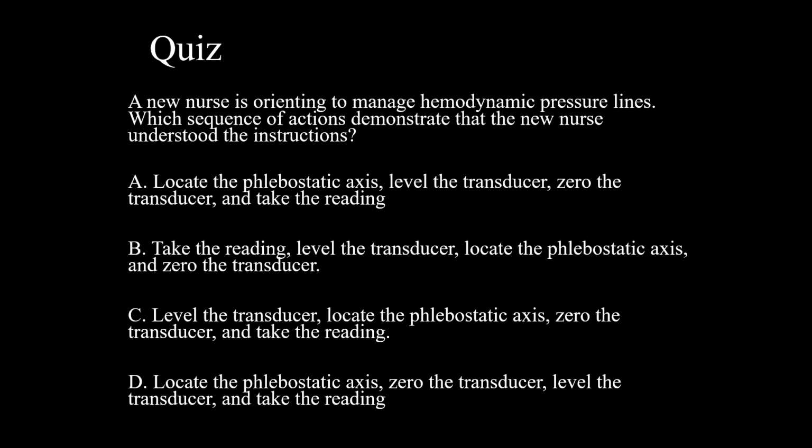Yes, thank you. Good. Okay, so what do you guys think the answer is here? Yeah, it's A. We've got to find the phlebostatic axis. We're going to level it. Then we're going to zero it. Then we're going to take a reading.